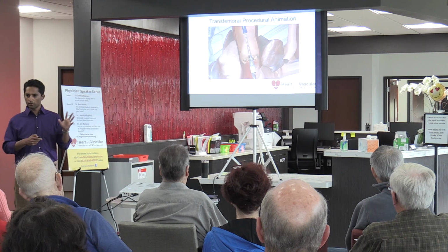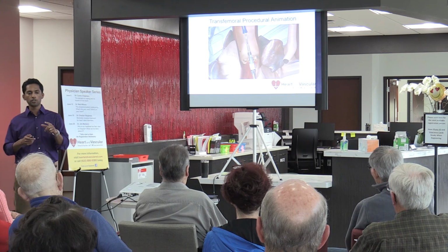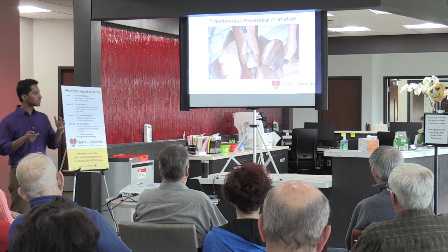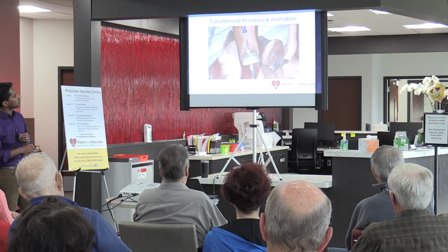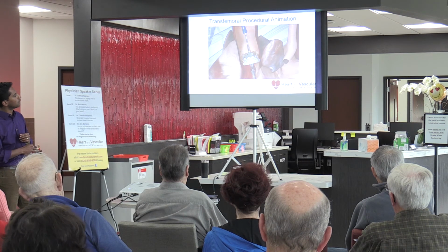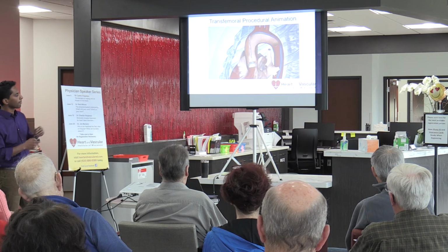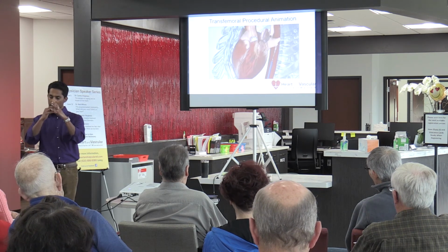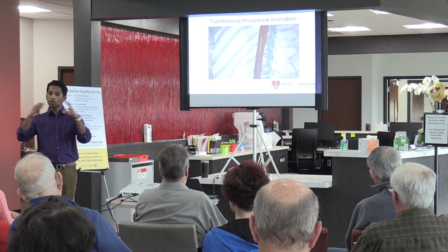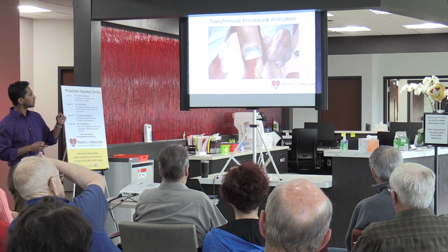So as you're probably starting to figure out, you don't actually remove your old valve, right? For the reasons that we mentioned, we need that thickening and calcification of the valve to hold it in place. The valve is inflated with a balloon, and then the balloon is deflated, and then that equipment is removed. And so what that balloon does is that it takes this crimped valve and expands it, and essentially crushes the old valve out of the way, thereby anchoring it in place.